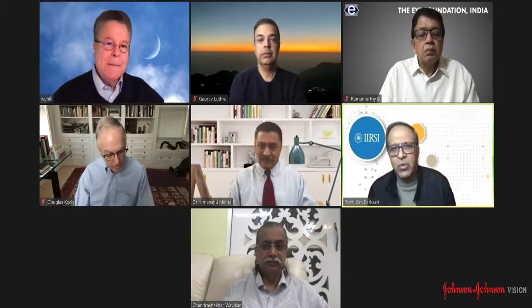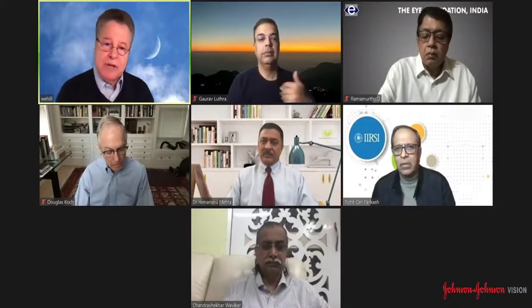One question which I would like to ask is, for post-refractive surgery, how is the Hill-RBF version 3 placed? Well, it turns out we can't use that at all, because for artificial intelligence to work, we have to have good metrics. And as Doug so eloquently pointed out, we really can't measure these corneas. It has to do with the Gullstrand ratio. Many of these eyes have a widely variable power distribution across the anterior cornea, and so the Gullstrand ratio may be different in different places.